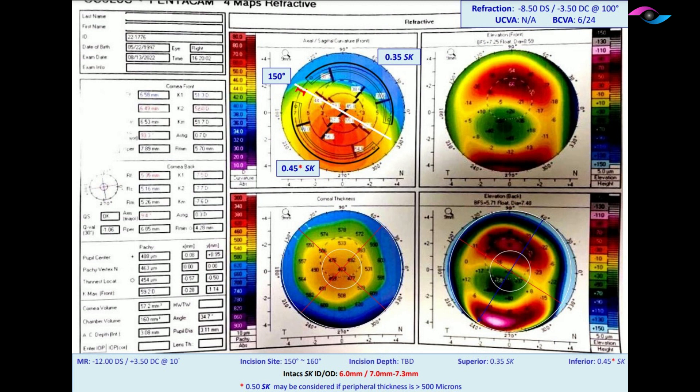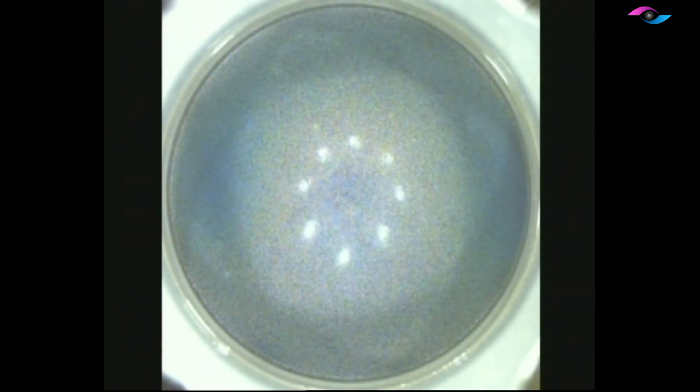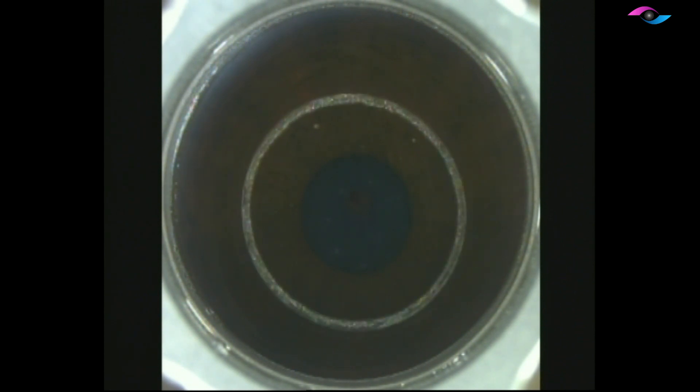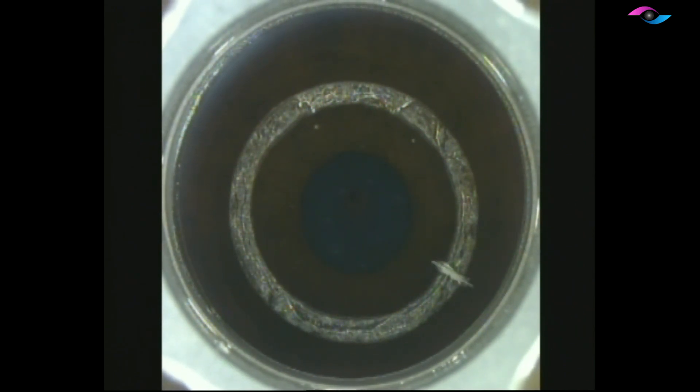By placing INTACS, we just want to regularize the cornea and hopefully decrease the refractive error. We are now docking at the femtosecond laser — this is the INTACS channel which we are going to create using the femtosecond laser. We can see these channels are being created at a predetermined depth, and the minimal corneal thickness needs to be 400 microns.